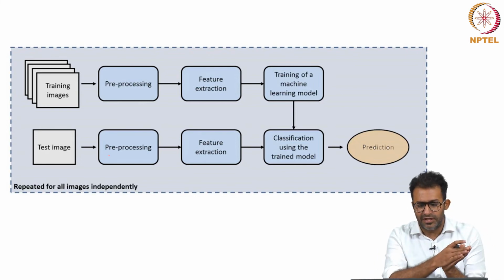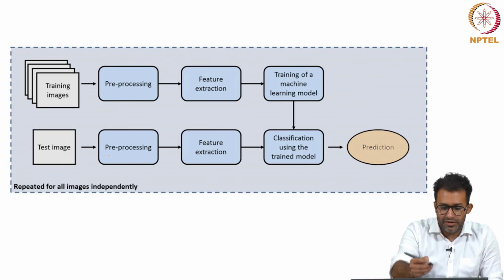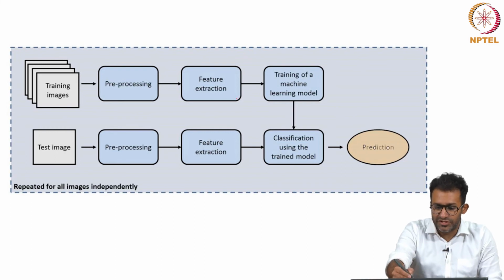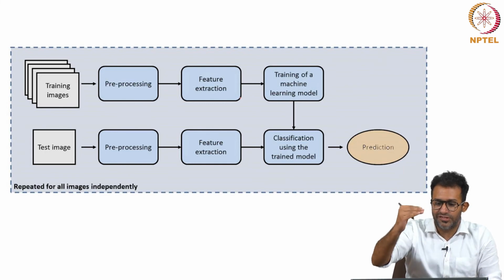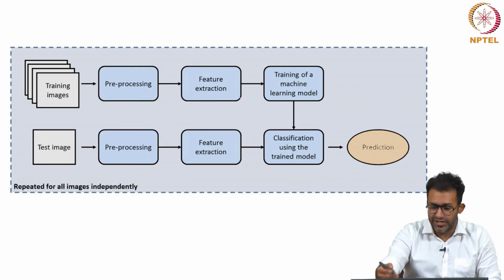They fed that information into a machine learning model. So, the training images were pre-processed to remove low quality images, and then the features were extracted. So, they took these two features, which is the signal intensity difference, and the presence or absence of layering, and they fed it into a model.